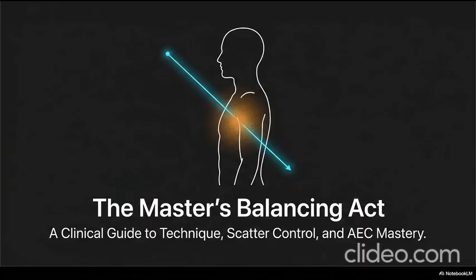This is why collimation is so crucial. Collimation, that's essentially shrinking the window, right? Exactly. You adjust the lead shutters inside the X-ray tube housing to restrict the size of the beam so it only hits the exact anatomy you need to see. So if you are examining a fractured wrist, there is absolutely no reason to use a beam the size of a chest. None at all. And the elegance of collimation is that it's a rare win-win in radiographic physics.